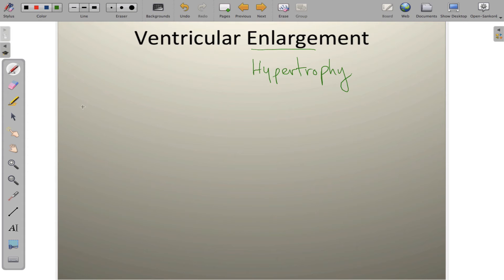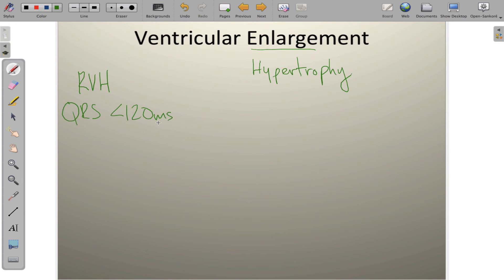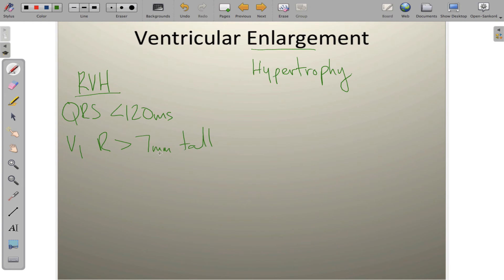Let's explore the rules. For right ventricular hypertrophy, the first important thing is to check that the QRS complex is of normal duration. If the QRS exceeds 120 milliseconds, we're most likely looking at right bundle branch block. In right ventricular hypertrophy, the QRS is normal duration, and in lead V1, the R wave tends to be greater than 7 millimeters in amplitude. A normal-duration QRS complex with tall R waves in V1 — think right ventricular hypertrophy.